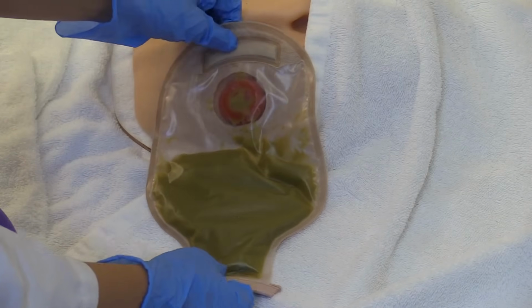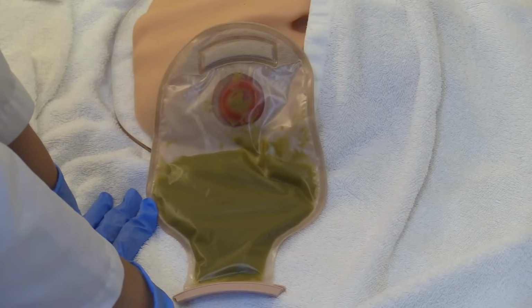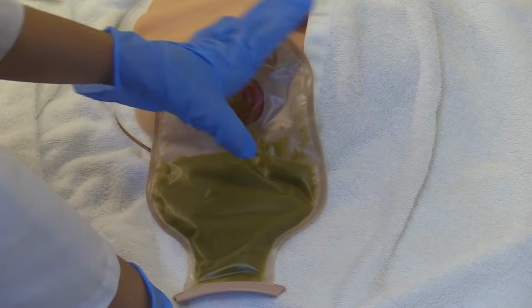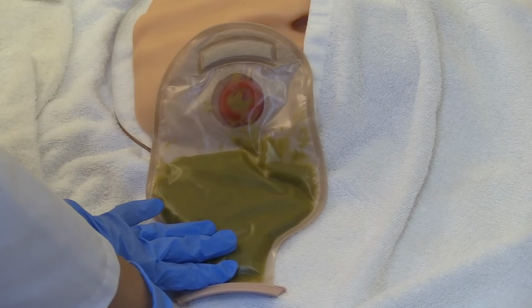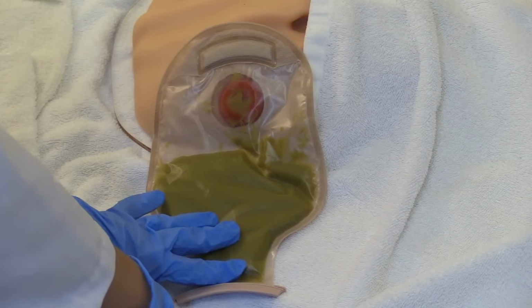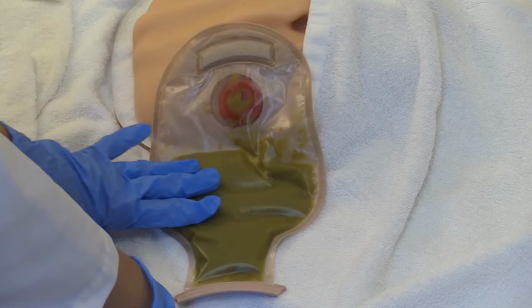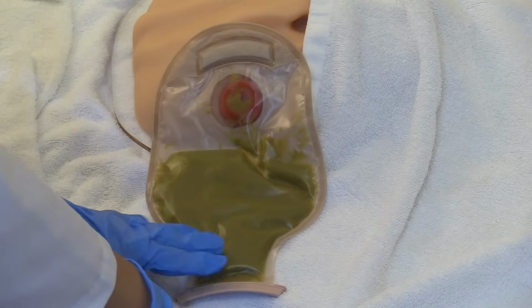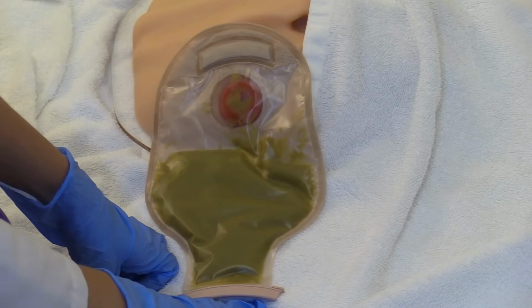Now, if you are a nurse who has a very sensitive nose and you're bothered by odorous smells, you need to be prepared for this because whenever you're changing an ostomy bag, there are some pungent odors. To help with this, you can maybe wear a mask. I've even known some colleagues to put vapor rub around their nose before they go in to change the pouch, so you have a menthol smell in your nose as you're changing it. So just be aware of that and prepare beforehand.